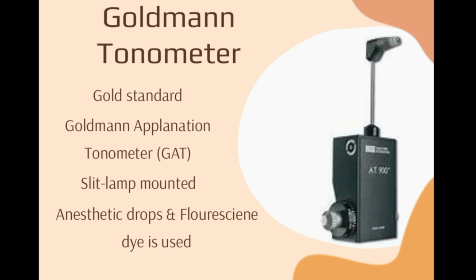The next thing is that it requires anesthetic drops. For this you have to give anesthetic drops to the patient, because we know that the cornea has a high sensitivity. The cornea has a very rich nerve supply.